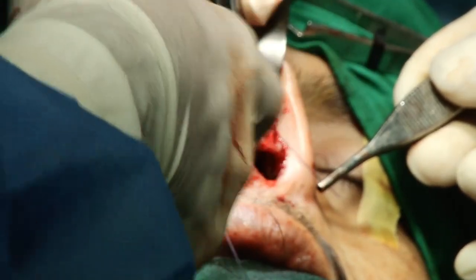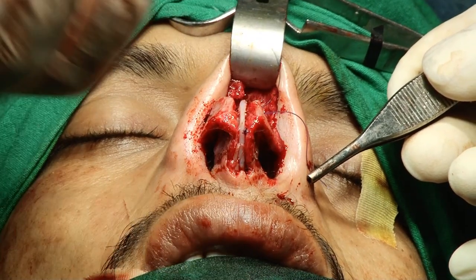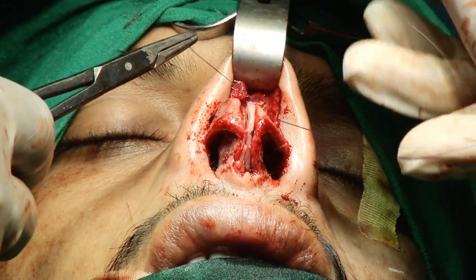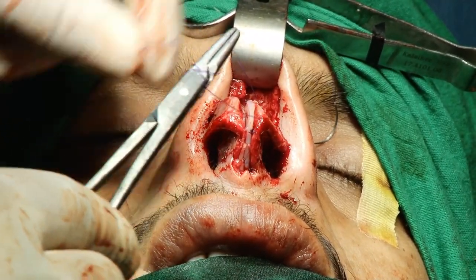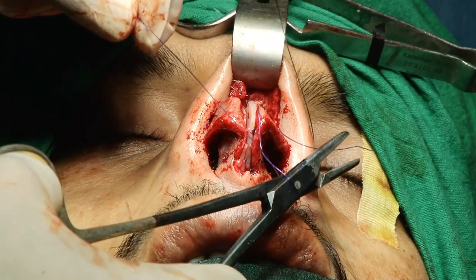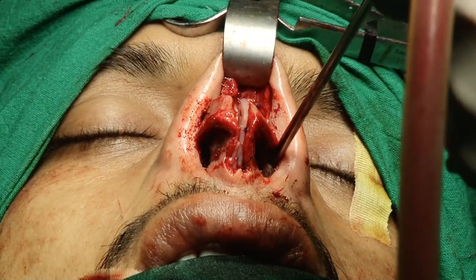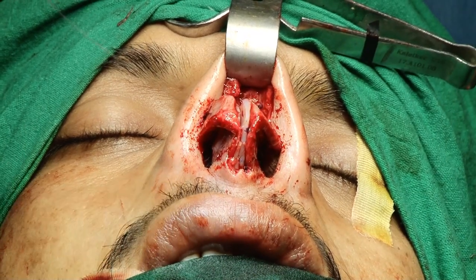Dome creating sutures and the interdomal suture also. They are the basic things, but when you use these sutures, you invert the caudal margin of the lateral crus, and you have the classical two tip defining points.